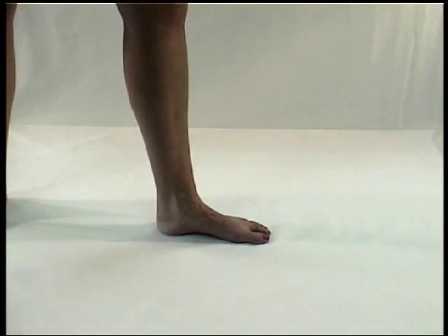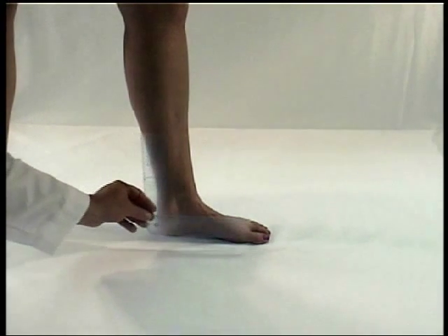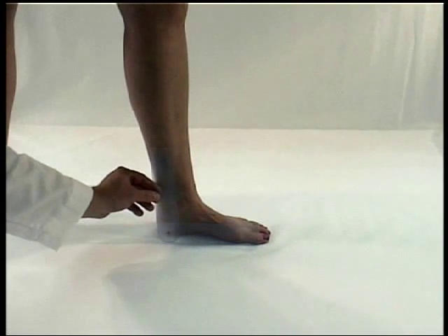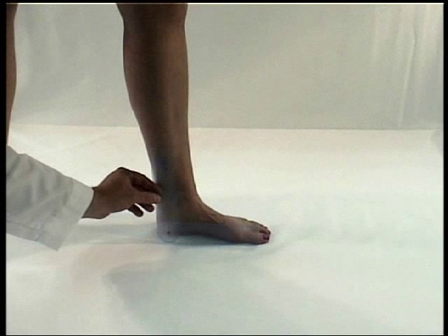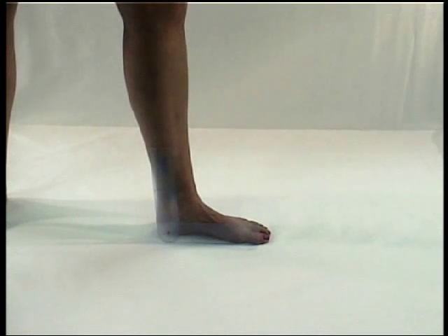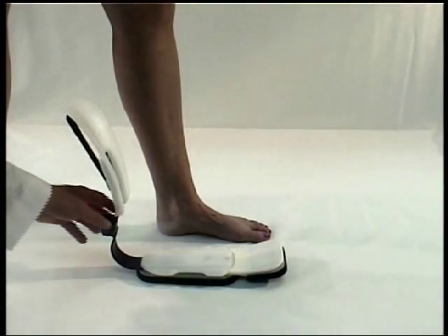In some cases, your patient may present with a tight heel cord, which will require an additional measurement of the foot-ankle complex. Again, with the patient either standing or supine, take a goniometric measurement of the patient's foot-ankle end-range position in the sagittal plane to determine the setting of the adjustable posterior single upright. You are now ready to apply all the measurements recorded toward the fully adjustable features of the device to ensure a proper custom fitting orthosis.